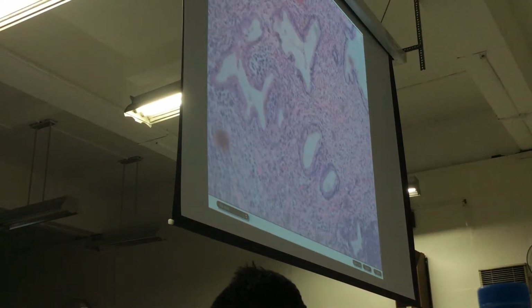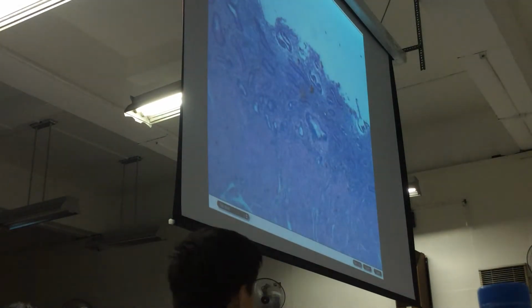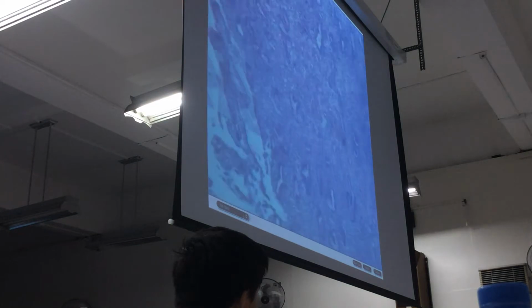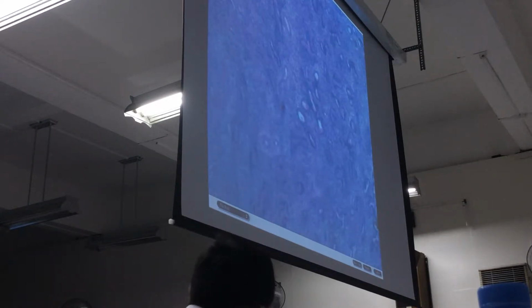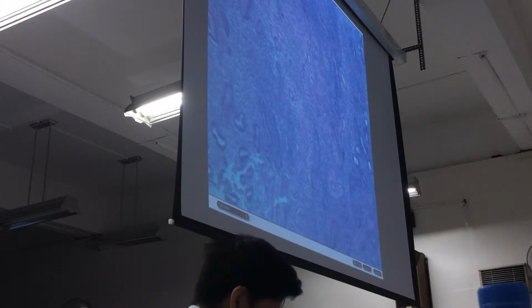Next, we have M1012, labeled in your slide boxes as simple hyperplasia. However, on focusing, you already see a change of the stroma to fibrous tissue and sclerotic blood vessels.